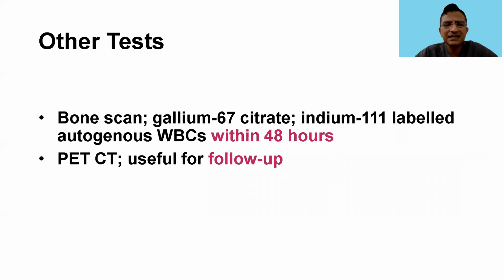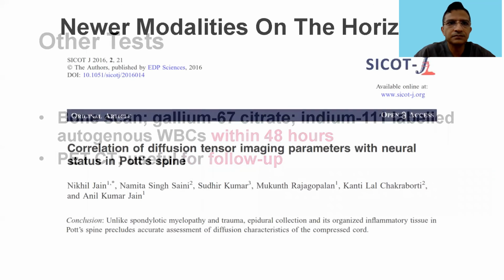There are a lot of other tests which have also been listed out, which I'm just listing out for the sake of completion. The use of bone scan: some of these scans can give us information related to infection even within 48 hours. PET-CT, though it is documented to be a useful investigation modality, is not very frequently used because of cost constraints and availability constraints. But yes, it can be used for diagnosis, but more so for follow-up of these kinds of problems.